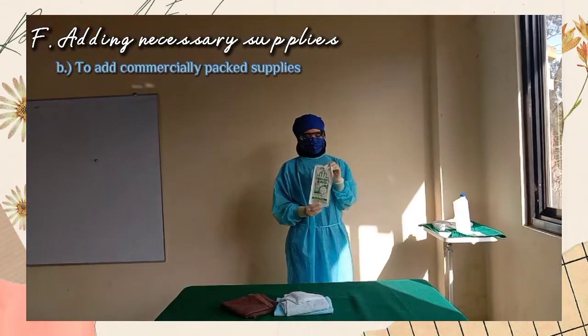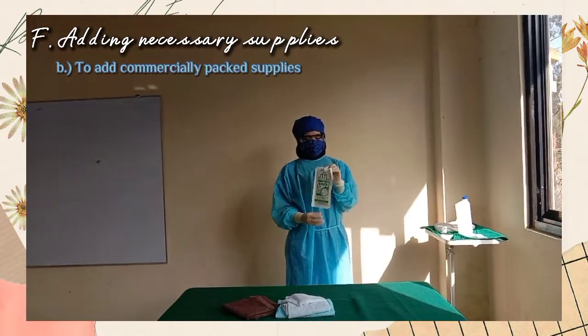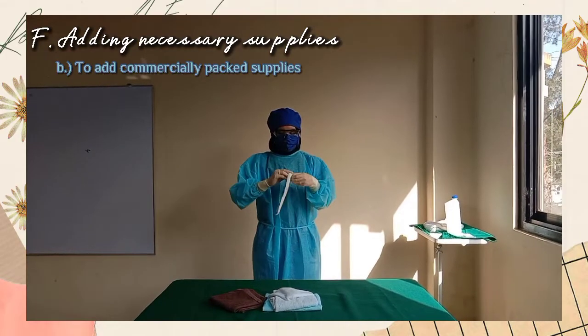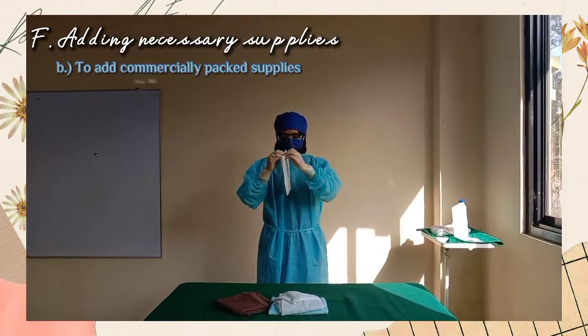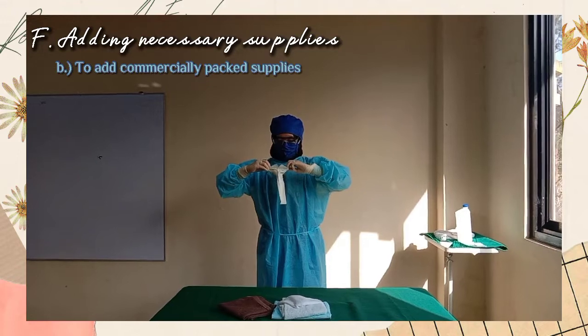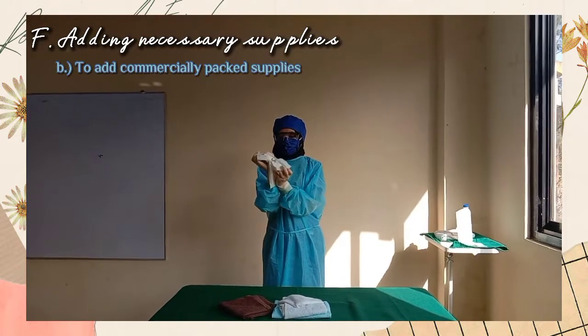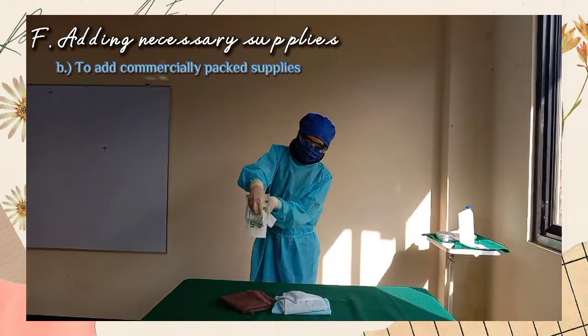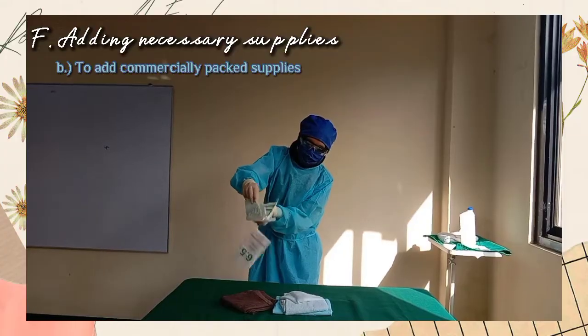Hold the package in one hand, pull back the top cover with the other hand, alternately and carefully peeling the edges apart using both hands. This would expose the package freely. After the top cover or edges are partially separated, hold the item 6 inches above the surface of the sterile field. Continue opening the package and drop the item onto the field. Be careful to avoid touching the surface or other items, or dropping onto the 1-inch border.